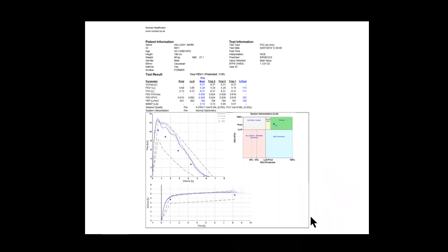It also gives us a lung age if we choose that within the options. That concludes the short screencast for the TrueFlow spirometer with integration into the Vision medical record. Thank you.